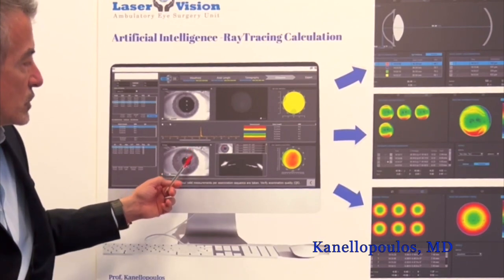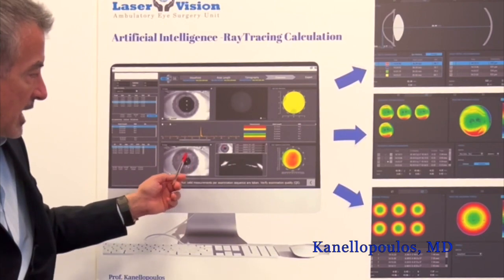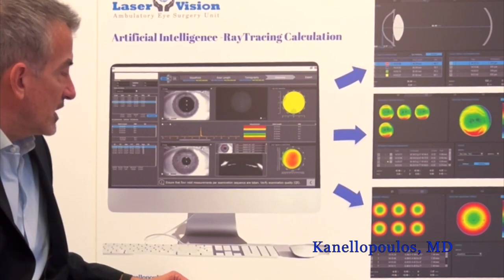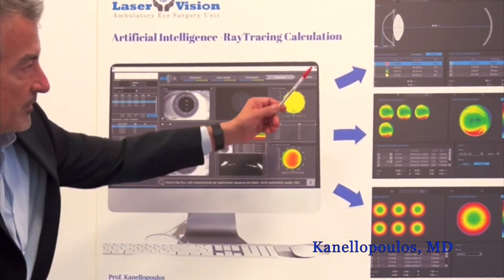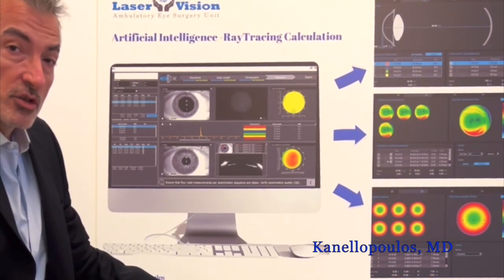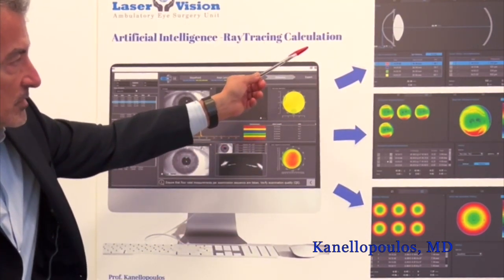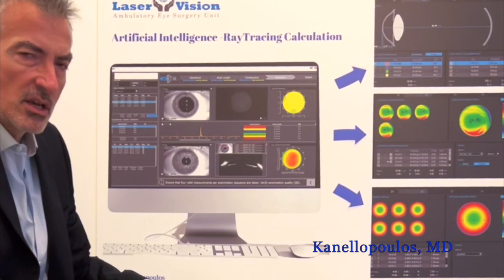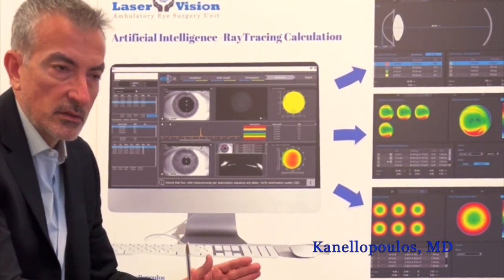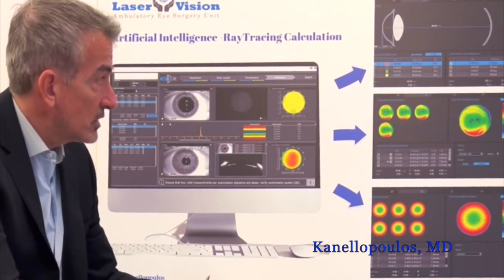Last, the device also is able to register iris anatomy and limbal anatomy with an infrared capture of that, and in essence give us, as you can see there on your right side, 3 sets of measurements. And the way this works is that initially, with the first set of measurements, the axial length measurements, and it's not just the axial length, it's in essence all the interferometry measurements: the distance of the anterior chamber, the thickness of the lens, and of course the vitreous cavity.